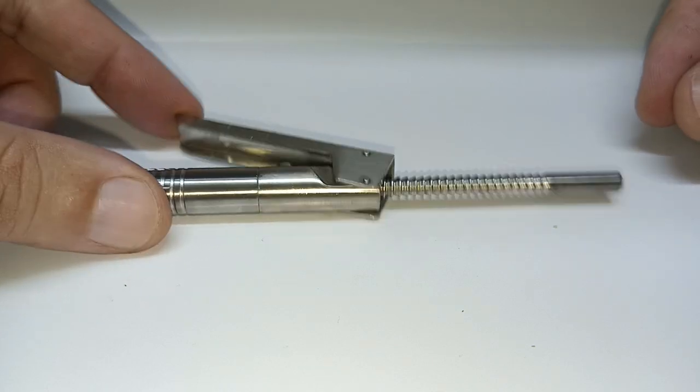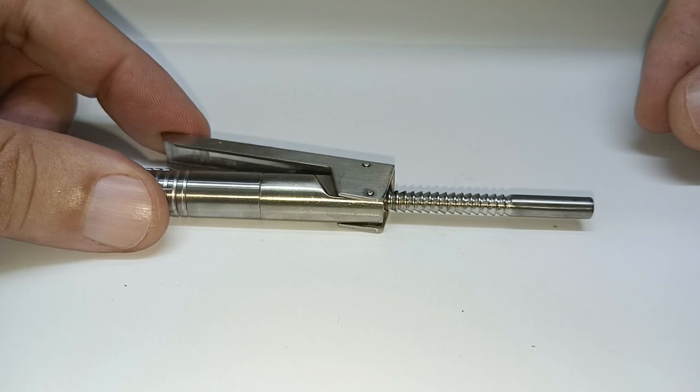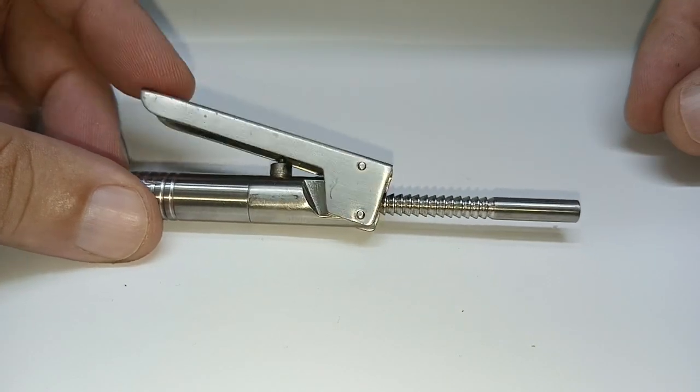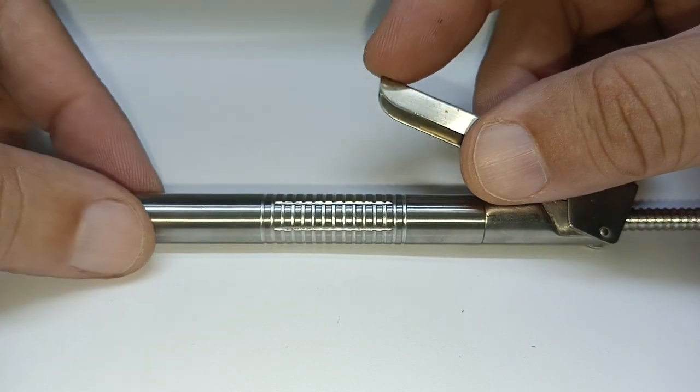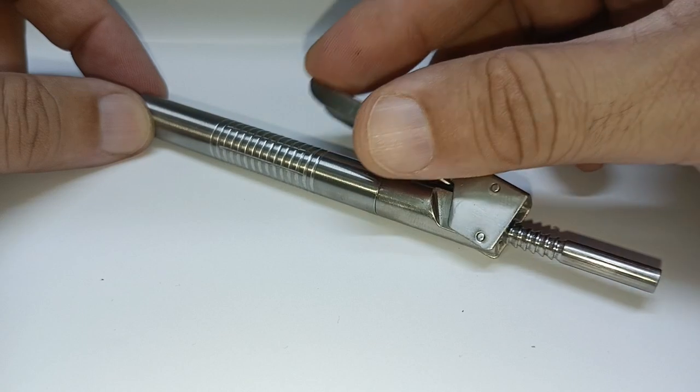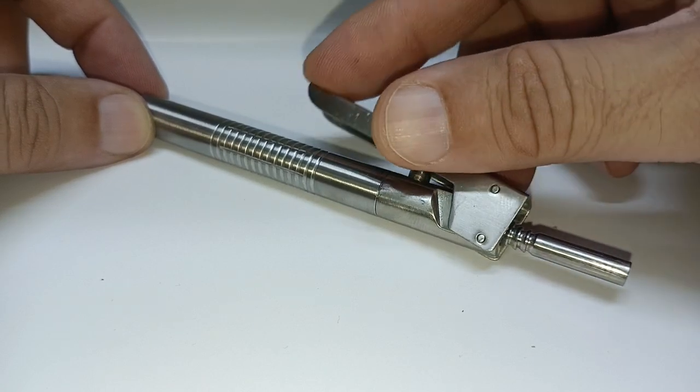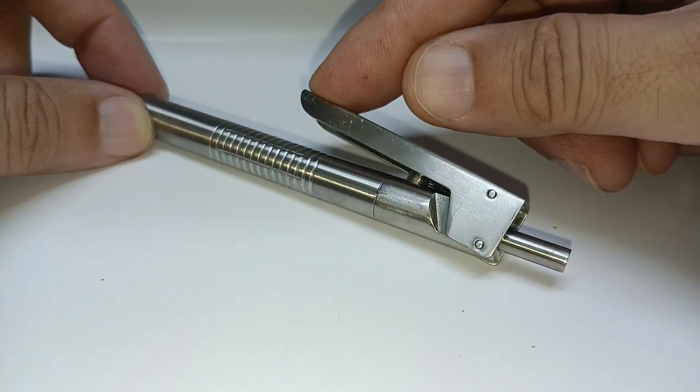Deeper and deeper every single time, and it keeps the pressure there. The fluid will keep on coming out from the needle tip with a lot of pressure till you utilize the whole ampoule. And this is how it goes.